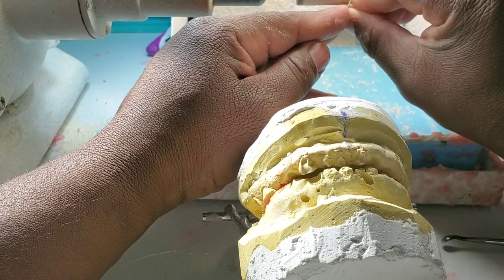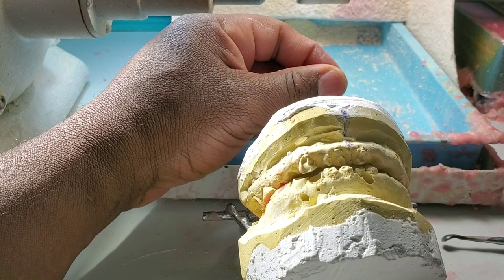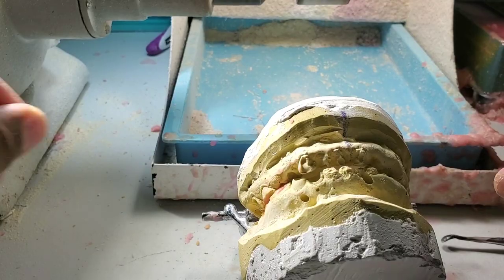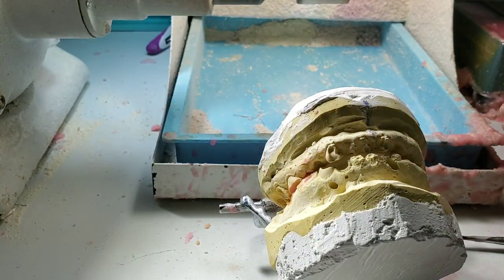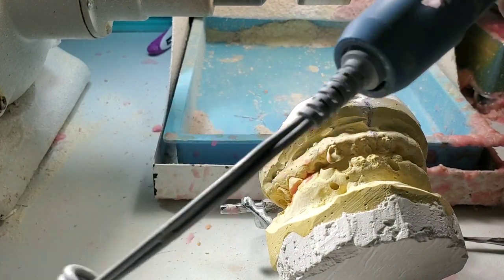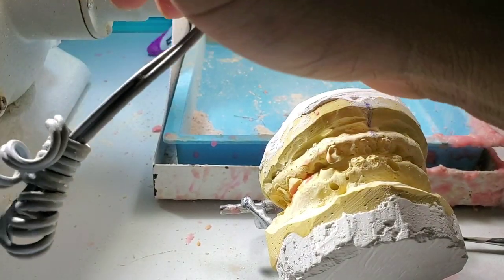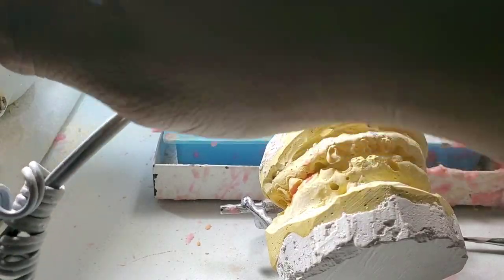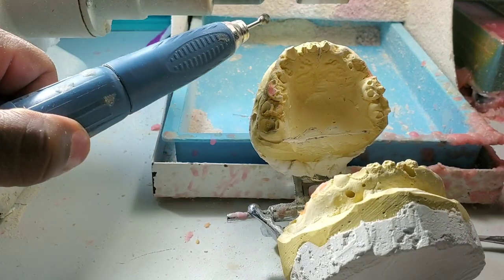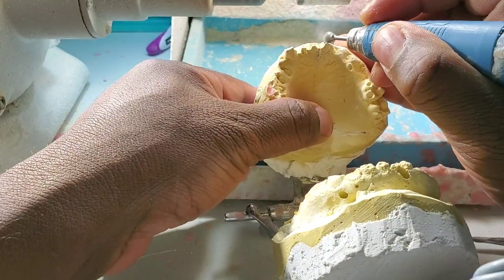I'm grinding the teeth so I can place them in the location and area I want. I'm turning my torch on, and I have my handpiece with me so I can grind. I'm turning on my suction so it can take all this dust away.